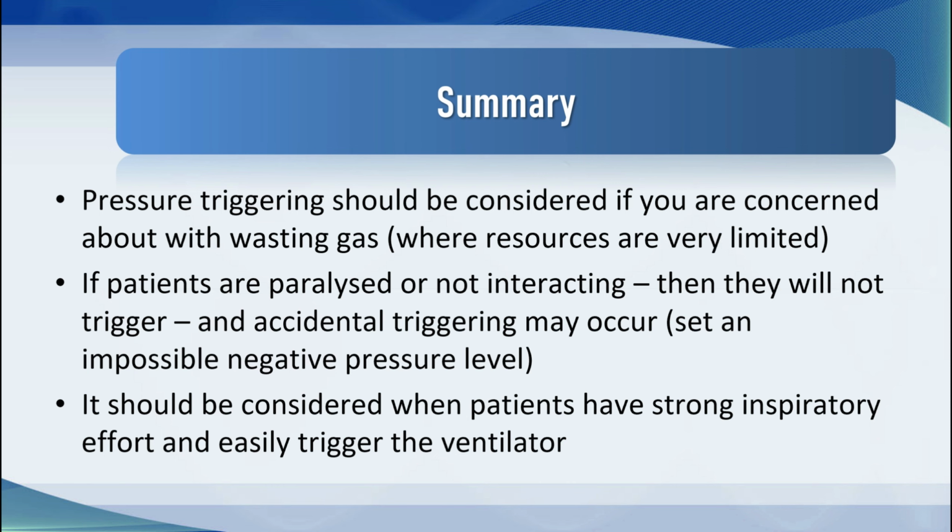Alternatively, in patients who have very strong inspiratory effort and easily trigger the ventilator, there is nothing to be lost except gas by using pressure trigger. So it's something to consider using if you're concerned about how much oxygen you have available to you.